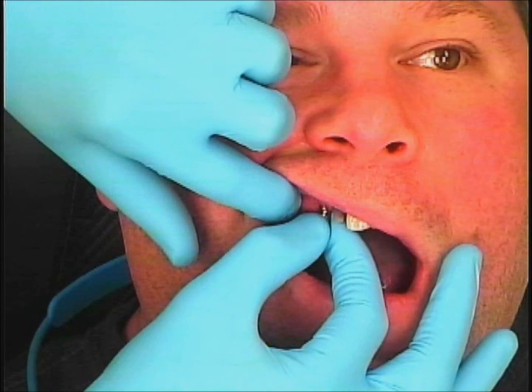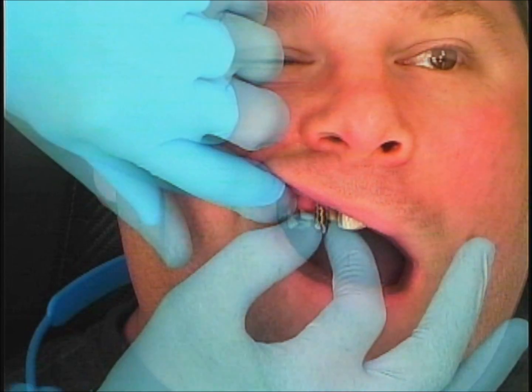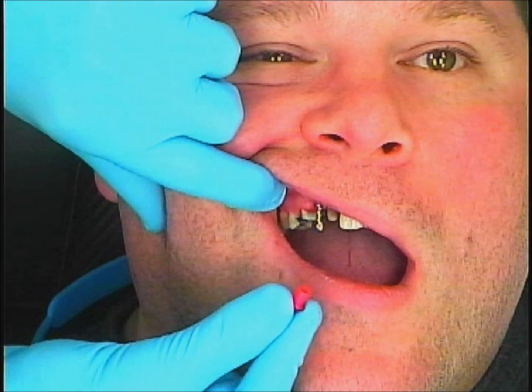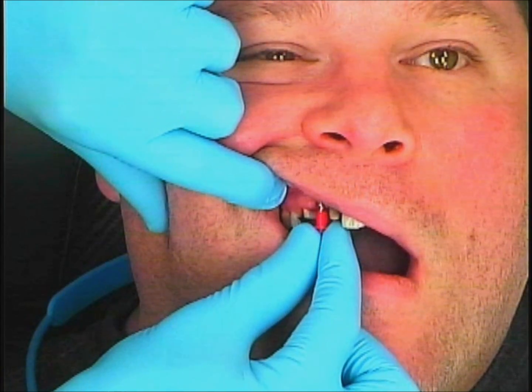Here you see me taking that retentive element and pin together as a unit and twirling that around until I feel that it is seated, and then once that is tightened down I can take my red cap and place that around.